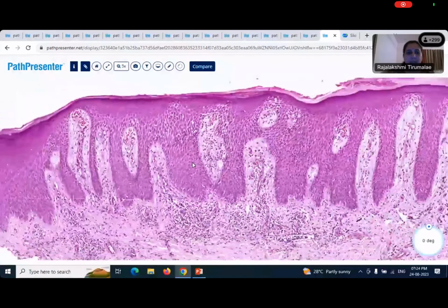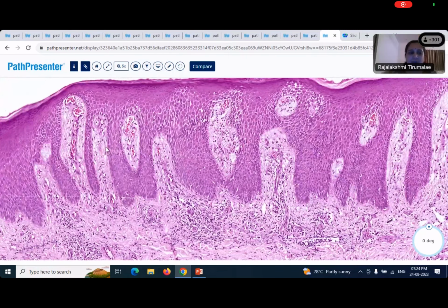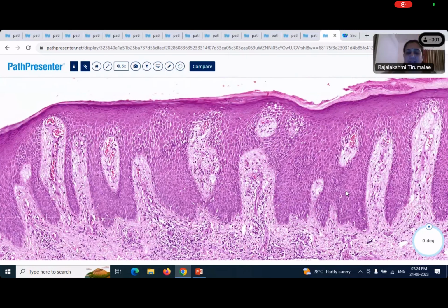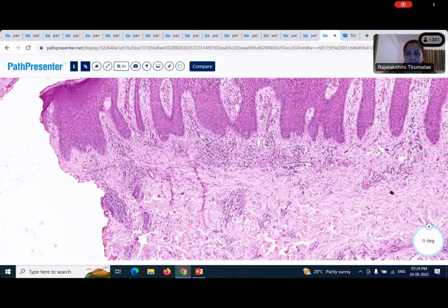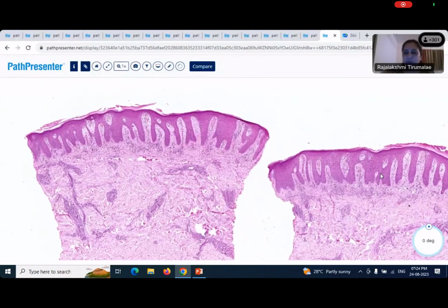Right. Okay. Now coming to the dermis, as you rightly said, there are dilated capillaries, and some people call this a kissing sign. These are almost kissing the stratum corneum because there is suprapapillary thinning. And do you know what this corresponds to clinically? Auspitz sign. Yes, very good. So this corresponds to the Auspitz sign clinically. And if you look at the dermal infiltrate, you have only lymphocytes. You don't see neutrophils or eosinophils, right? So the other tissue bit also looks pretty much the same.